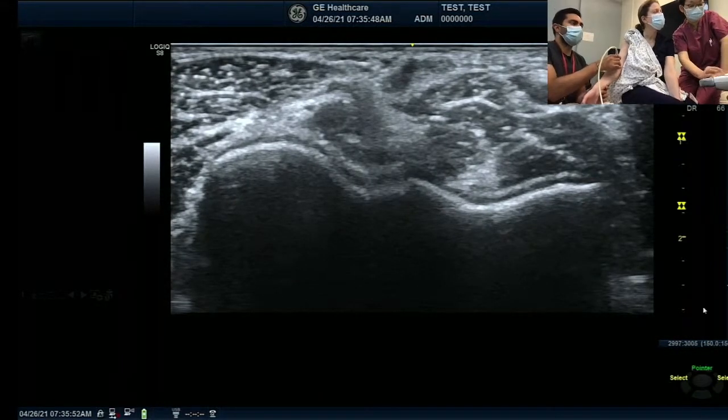Look at this. This is the brachial artery. This is median nerve. These things are pronator teres. This whole thing is above the humerus. This pyramidal shape is the brachialis, right? It's the biceps tendon, I guess. The biceps tendon is this white one. Yeah, this is the biceps tendon. Bingo. And then we're going to move to the radial side.